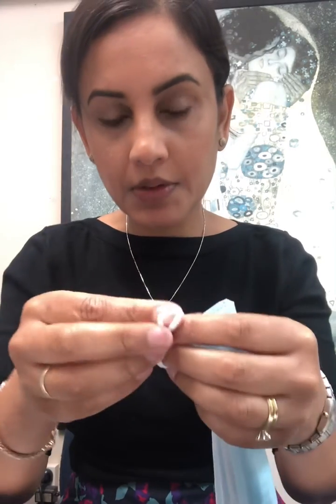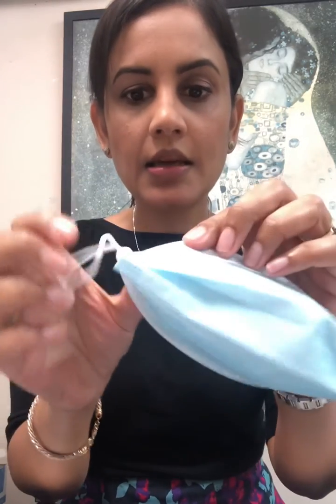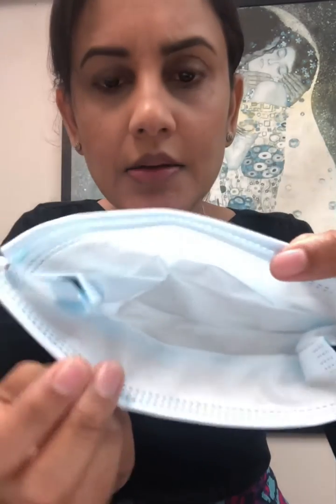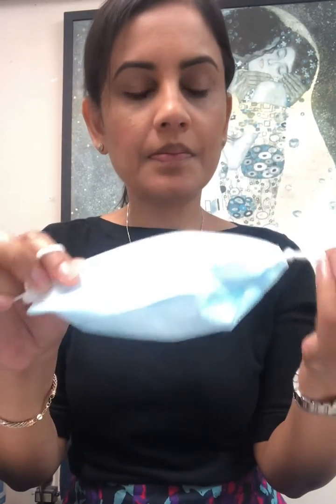Do the same on the other side. So your mask now looks something like this. Then take it and tuck in these edges — it's going to look something like this on the inside. Then just take the loops and pop them on your ears.